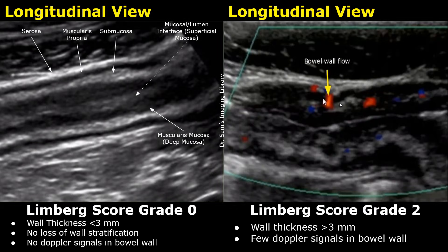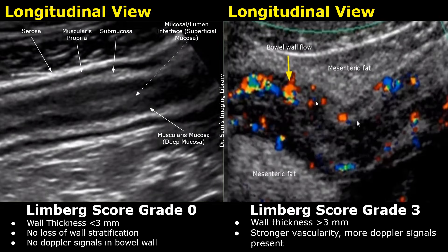In grade 2, wall thickness is greater than 3 millimeters and a few Doppler signals are noted in the bowel wall. Wall stratification looks preserved but some color Doppler signals are visible, hence the grade 2 score. In grade 3, the vascularity is stronger than grade 2 — a significant number of Doppler signals are seen. However, some areas still do not show increased vascularity, so it is classified as grade 3.